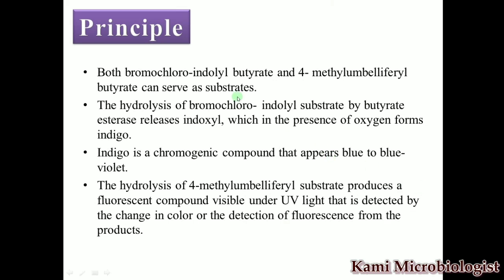It's very simple. We have bromochloroindole butyrate acting as the substrate. In this case we have an enzyme called esterase that is produced by Moraxella.